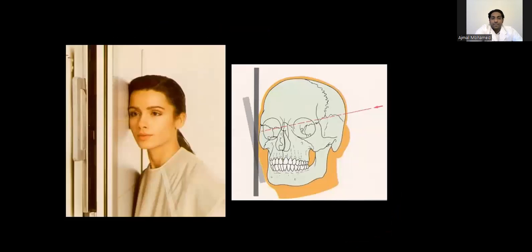I can show you the picture. So this is the picture. When we take it, we have to see. Remember, this transcranial, transpharyngeal, and transorbital technique, all these three techniques can be done with the help of a normal dental X-ray machine and a dental chair.